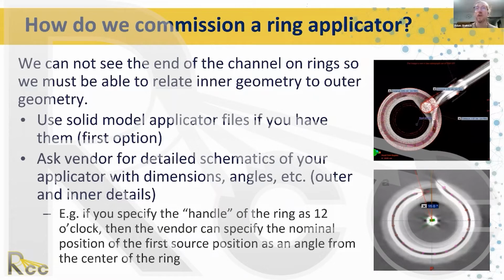Yeah, good question. So again, different vendors handle this differently. Varian, for example, will give you equal step sizes. And that's correct, Tim. So you can change this. In this case, I think I've got 5mm step sizes from center of source to center of the next. I could do 3mm step sizes in Gammamed. I could do 1 cm step sizes in Gammamed, but it will always be exactly 1 cm between, or in this case, 5mm between center of source to center of source.